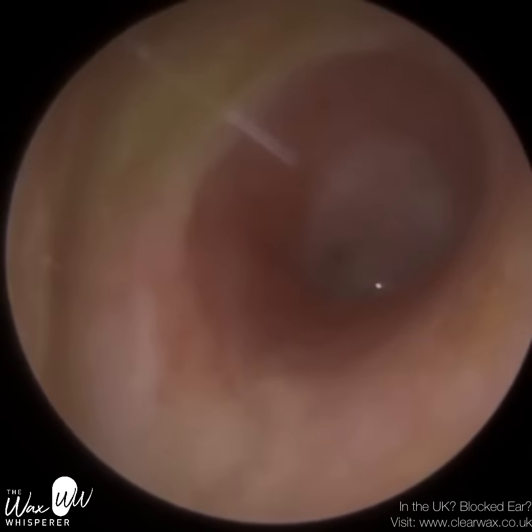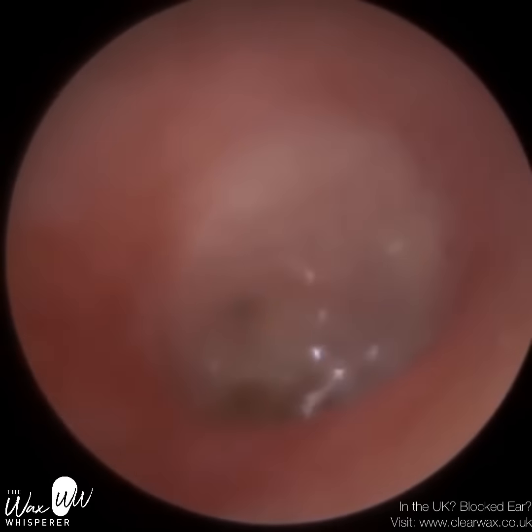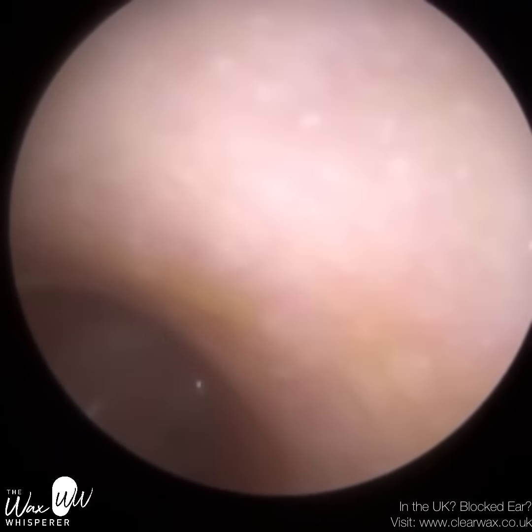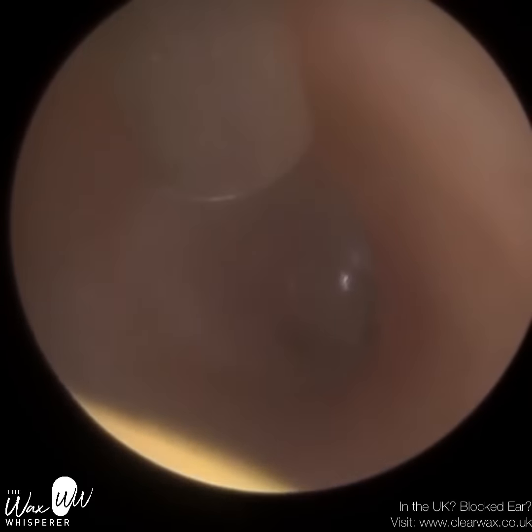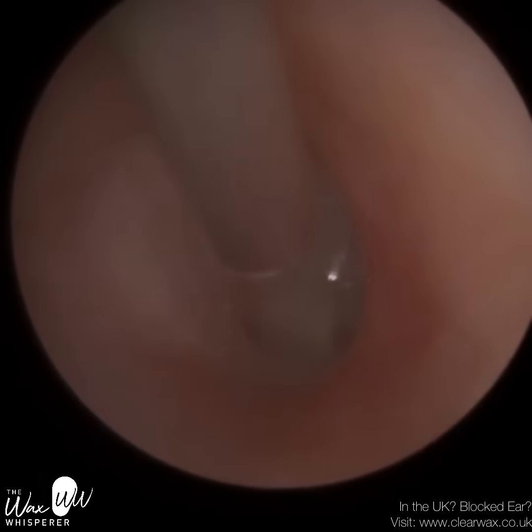So this is the right ear. Now, it's initially a bit misty, but that's because when you've got an infection, there's increased temperature, so it can fog up the lens. However, with the endoscope, it's great. Within a second or two, it demists, especially when I put the sucker in. So we're just trying to, it's so wet in there at the moment, and it's very hard to visualise exactly where this hole is and what's going on in there.